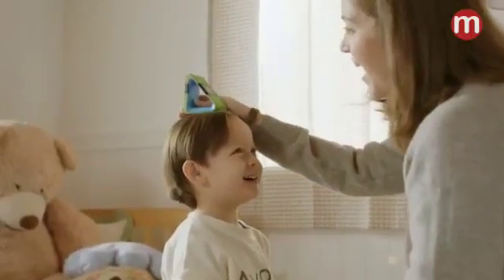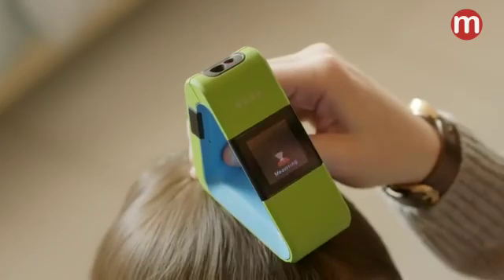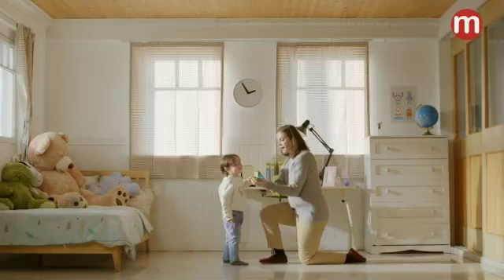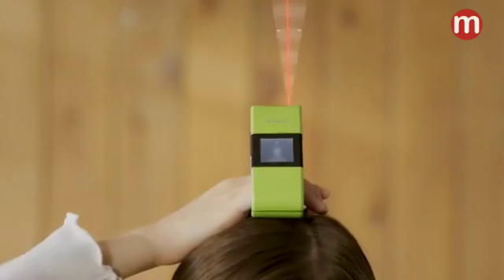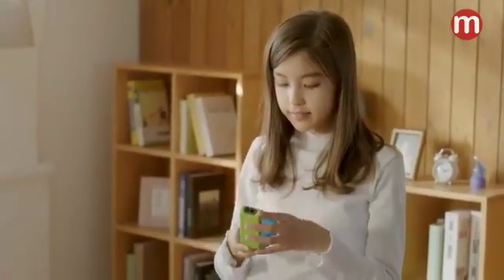Kiko Height Measurer is portable and easy to use. Because it measures height with a laser, it's quicker and more precise, so you can get accurate figures in a second. Even when it's tilted, auto-calibration technology will automatically compensate for any errors, giving you exact measurements.